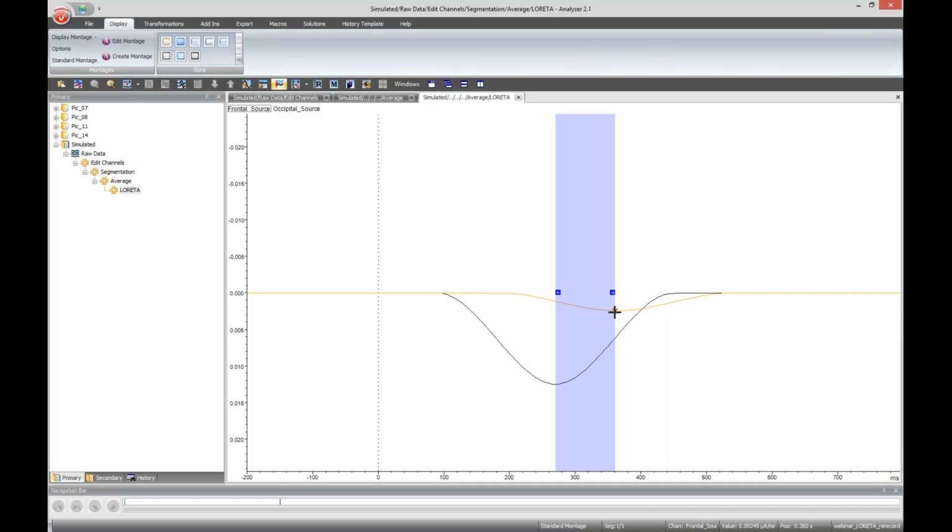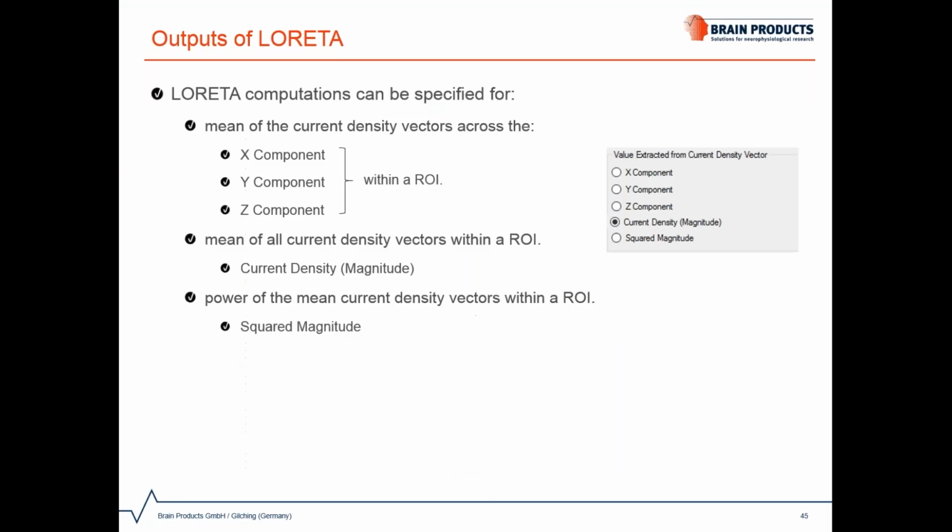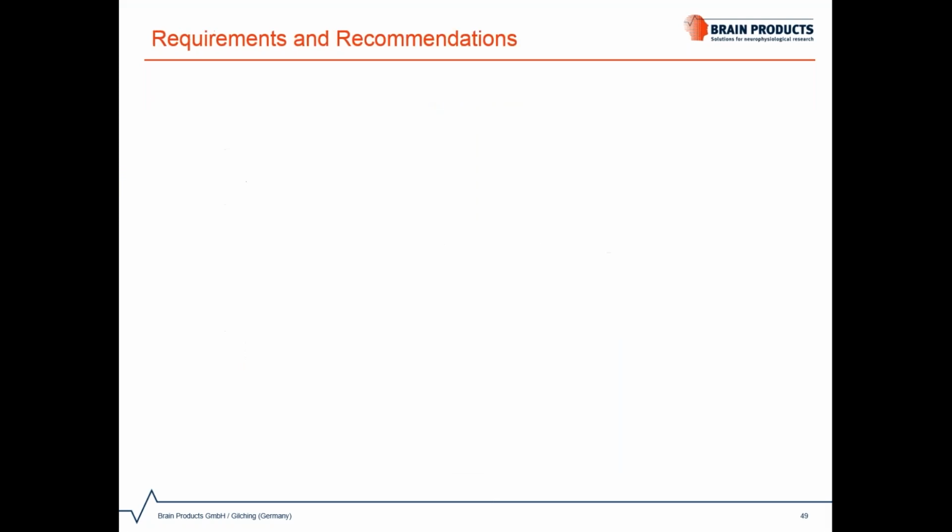But before that, let me briefly go back to the slides and tell you about certain requirements and recommendations that need to be taken care of before applying LORETA.